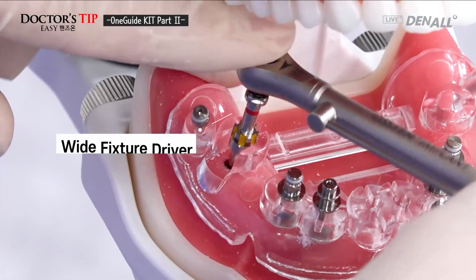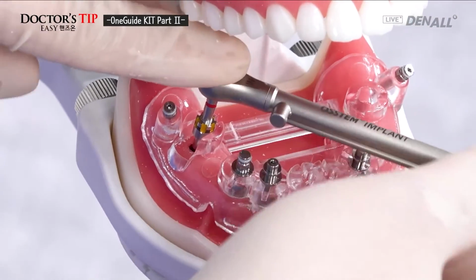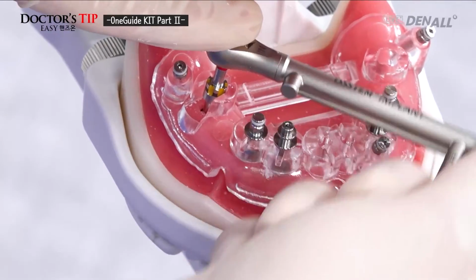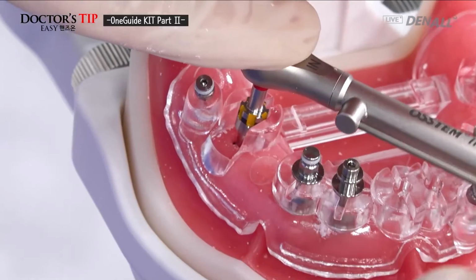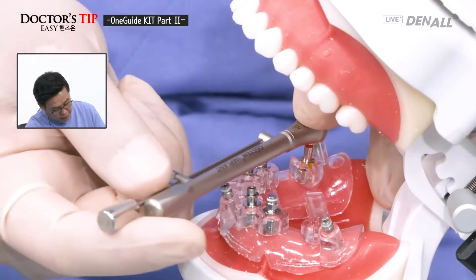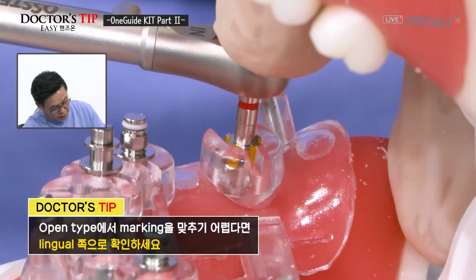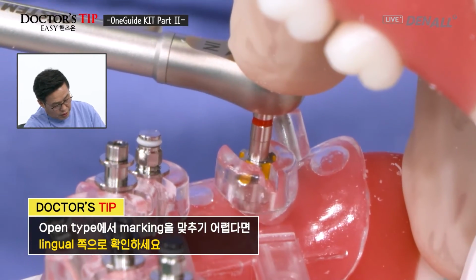Hand wrench is going to be used to check the final position. As you can see, this is open type. If you cannot see very well, you can look at the lingual side of the opposite side and check and get the accurate position.